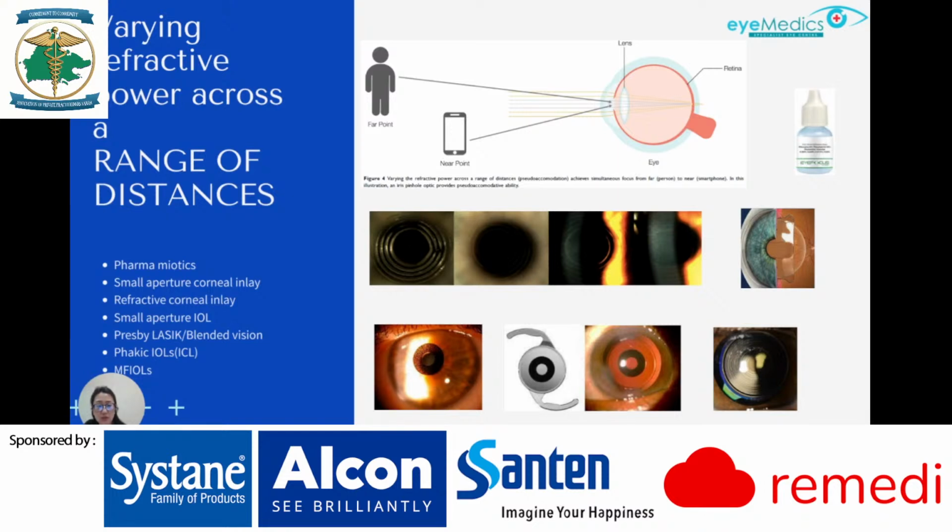With this mechanism, objects at all distances appear in simultaneous focus, and thus continuity across the field of view and also between eyes is preserved.